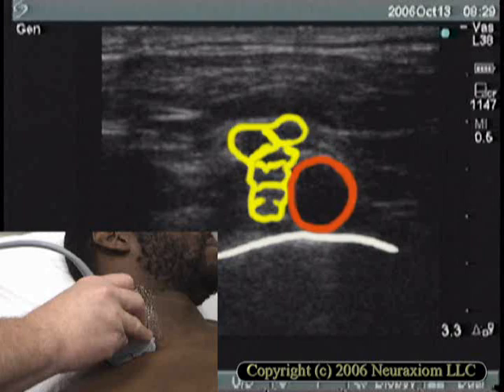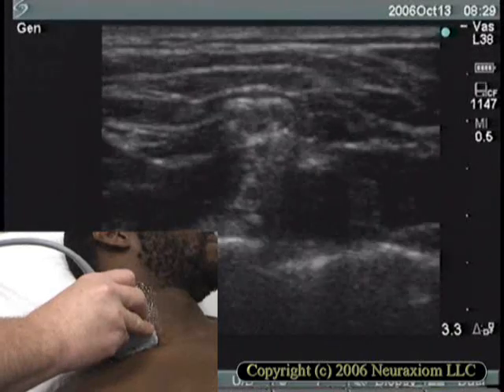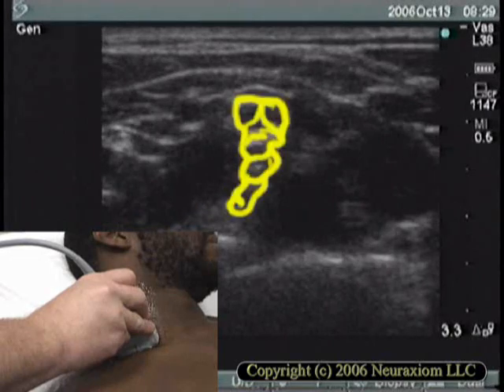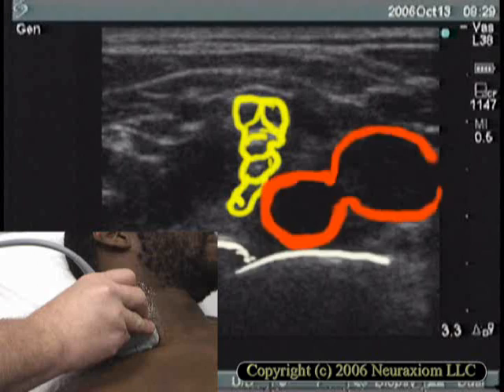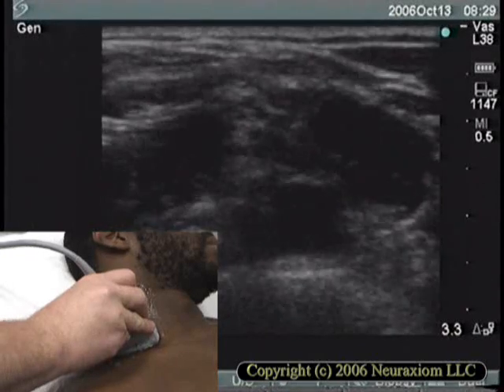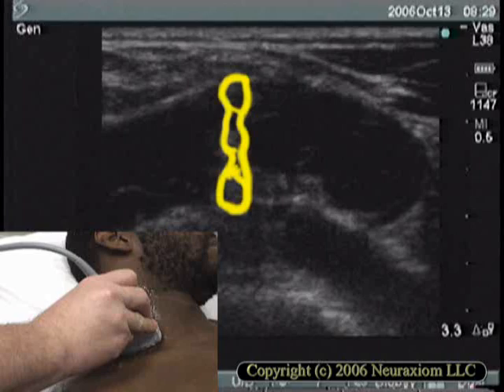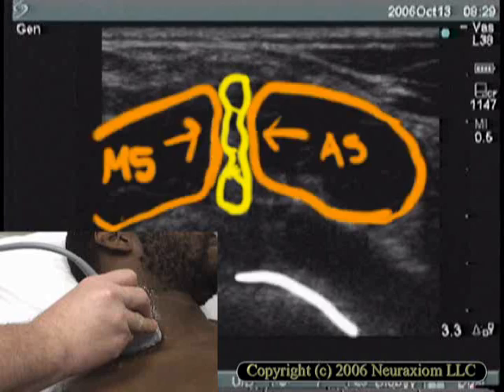Now we'll move the probe proximally along the line of the brachial plexus, stopping along the way to note the change in the configuration of the nerves. We see the nerves have changed from a cluster to a stack. This is because they're passing between the scalene muscles. Our view of the artery changes as we follow it back toward its source. Now we're at a low interscalene view, and the nerve trunks in their sheaths are pressed into a stack between the two scalene muscles.